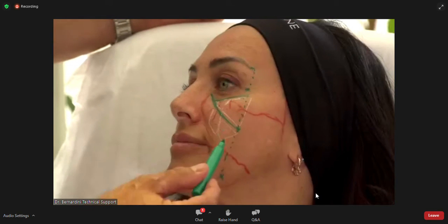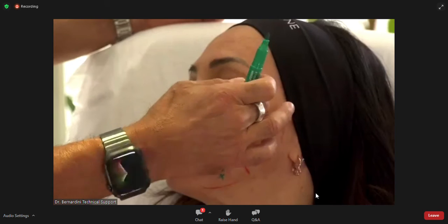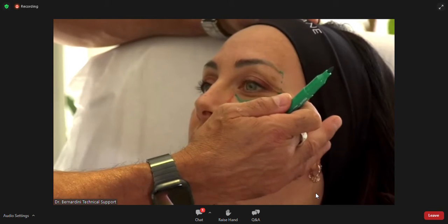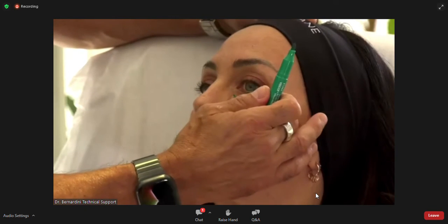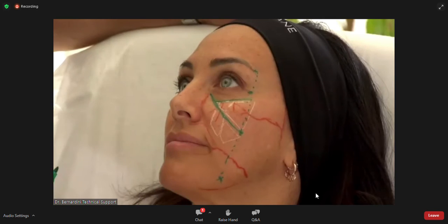So we'll keep that in mind because the G point will be outside of the lateral line of ligaments. And by injecting laterally to this point here, what we want to achieve is a stretch to the ligaments, to the orbital retaining and zygomatico-cutaneous ligament, indirectly, in order to achieve an improvement already in the center of the face.